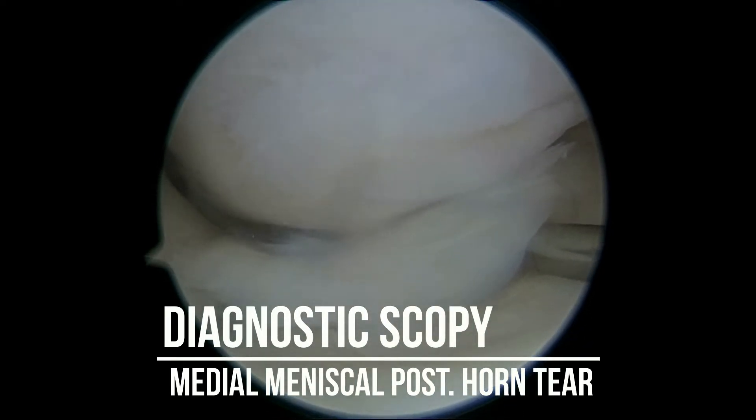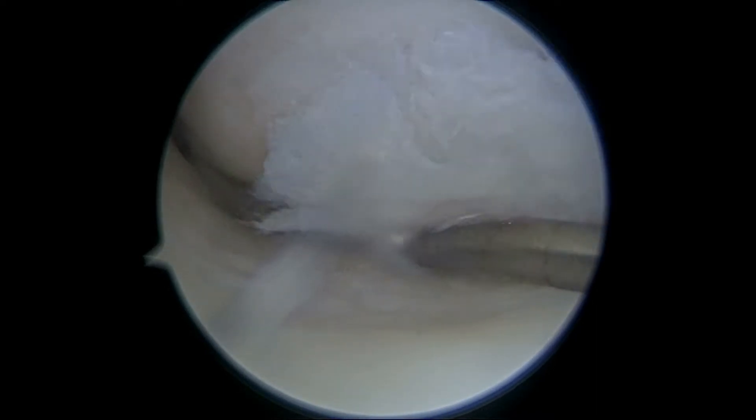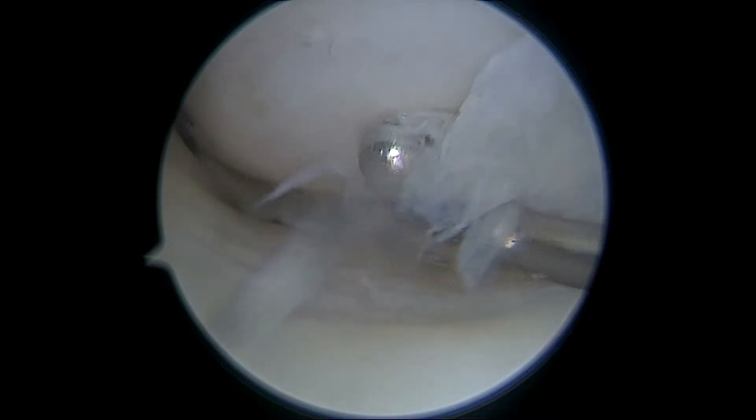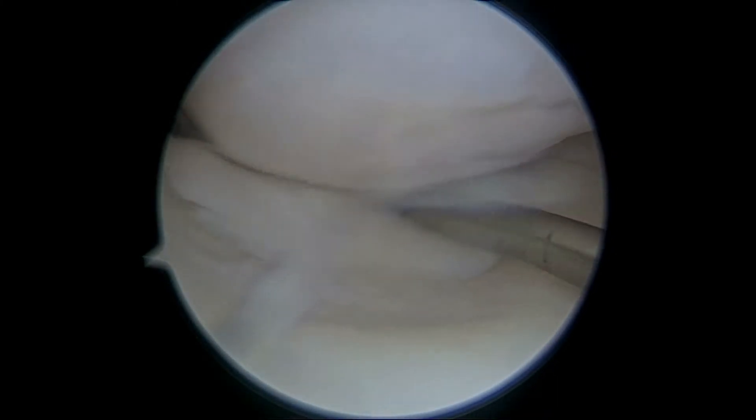This tear is a partial tear and does not involve the complete surface of the posterior horn. This has probably been a major reason for the cartilage injury on both the medial side of the femoral condyle and the tibial condyle. This is the probe which is used to pull that out.